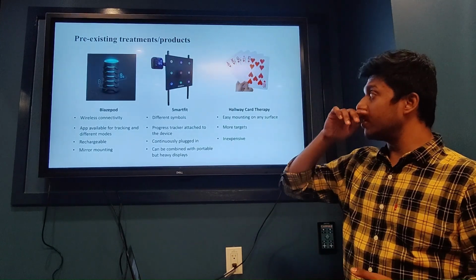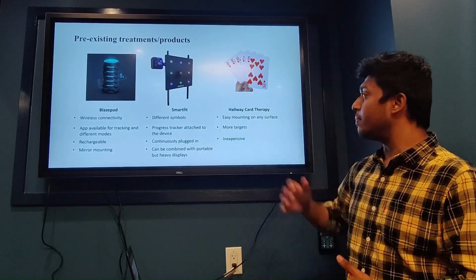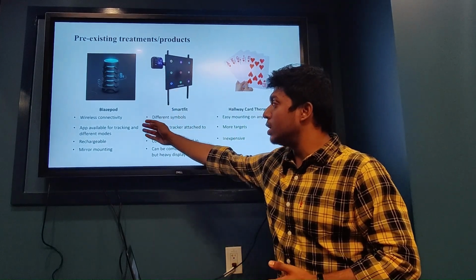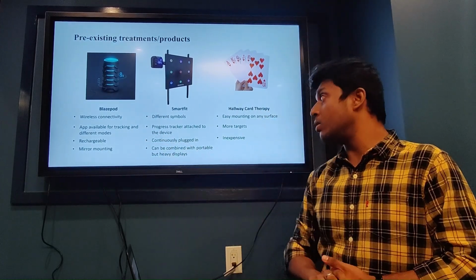Moving on to the pre-existing treatments or products, we have 3 things. We have 2 products and 1 kind of therapy that is used currently. So the Blaze Pod is a wirelessly connected set of pods. They have an app, they're rechargeable, but they're only mounted on mirrors.